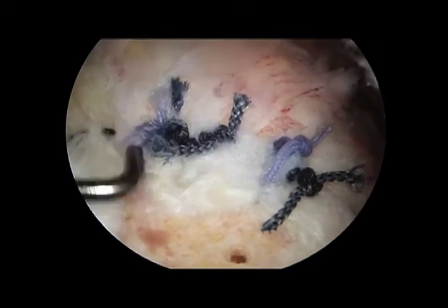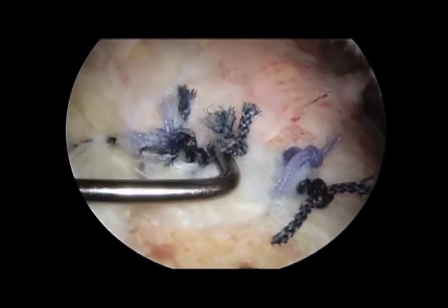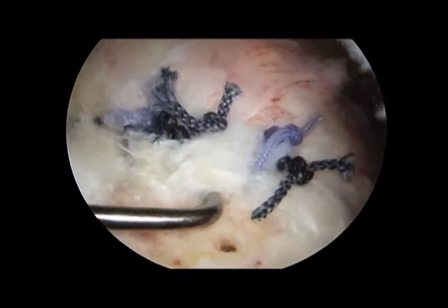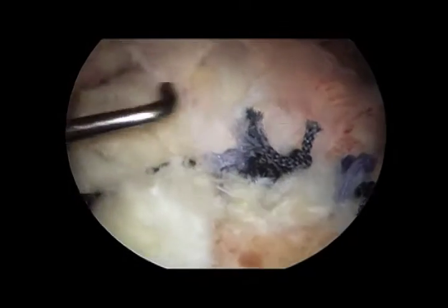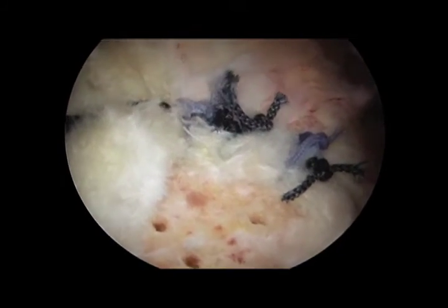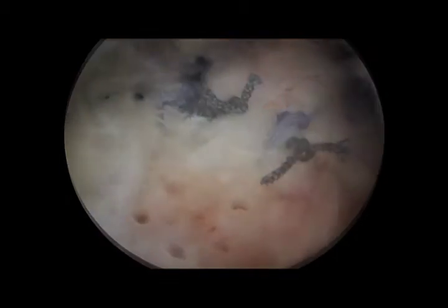We can again appreciate our suture configuration while viewing from the lateral portal, noting well-tied knots with excellent loop and knot security. We see the posterior L-shaped component of the tear well reduced with the side-to-side horizontal mattress suture, and the remainder of the tear firmly secured under an appropriate level of tension using a combination of simple and horizontal mattress sutures, including a modified Mason-Allen stitch.